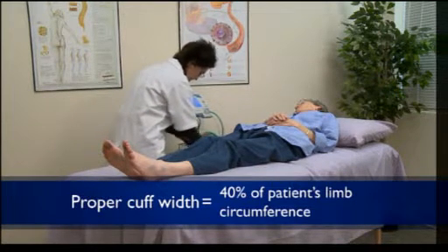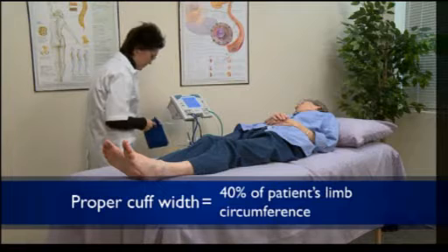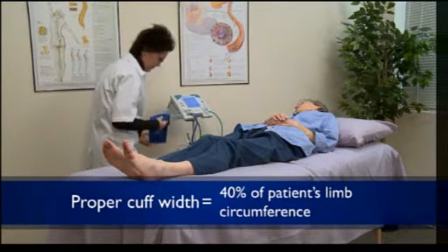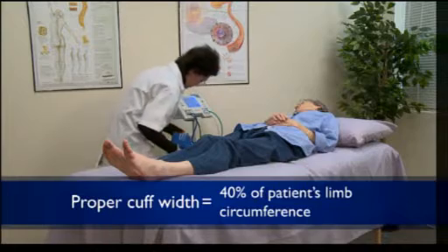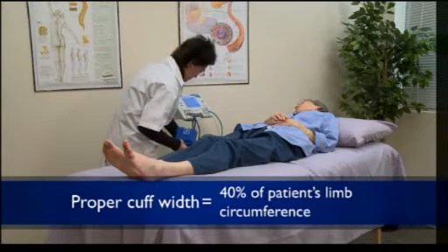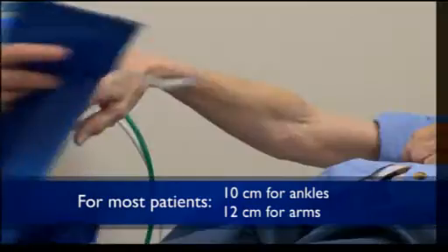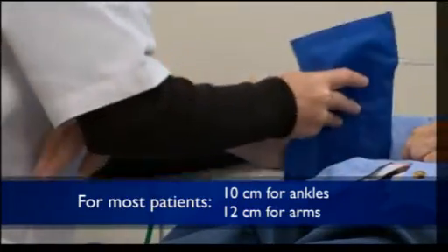For limbs with a circumference less than 28 centimeters or 11 inches, use the 10 centimeter cuff. For larger limbs, use the 12 centimeter cuff. For most patients, a 10 centimeter cuff is used at the ankles and a 12 centimeter cuff at the arms.